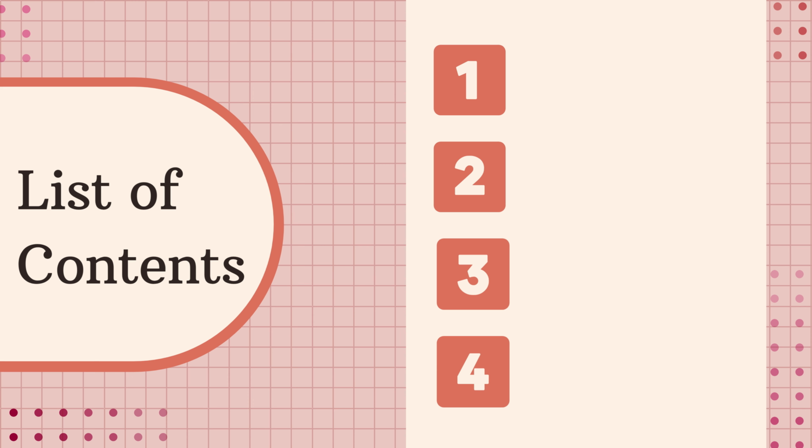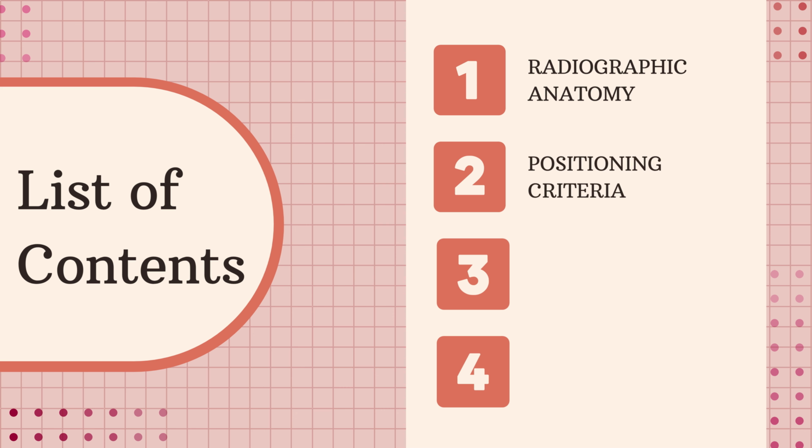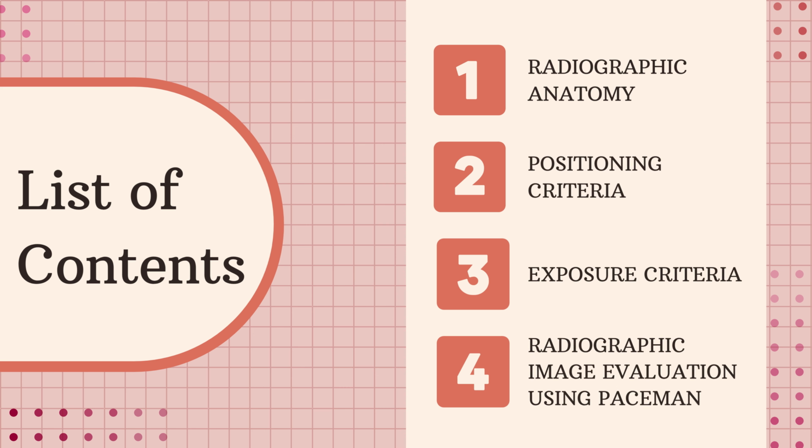This is the list of contents in this presentation. It consists of radiographic anatomy, positioning criteria, exposure criteria, and radiographic image evaluation using the PACEMAN method.